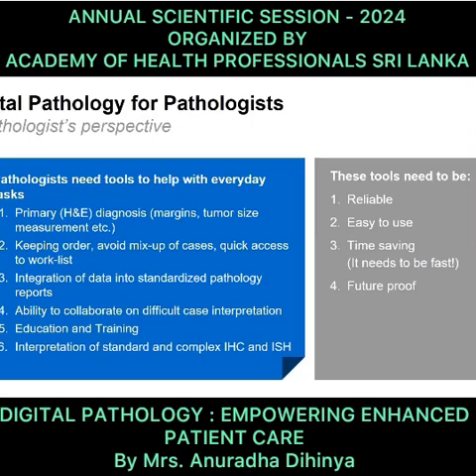Seamlessly, it can be used for the education and training part. With my experience, where we have installed digital scanners in medical colleges in my country, what we have noticed is that apart from education, they are also using them for examination purposes. Earlier they used to place multiple microscopes to look at the slides, with spot cases.